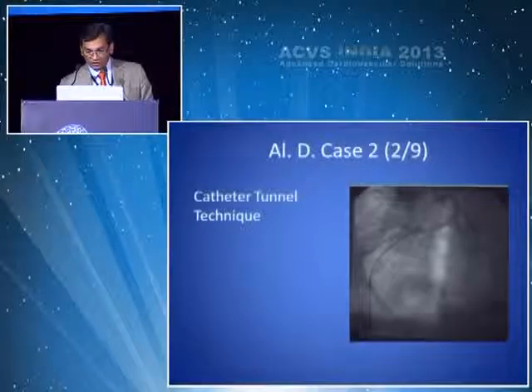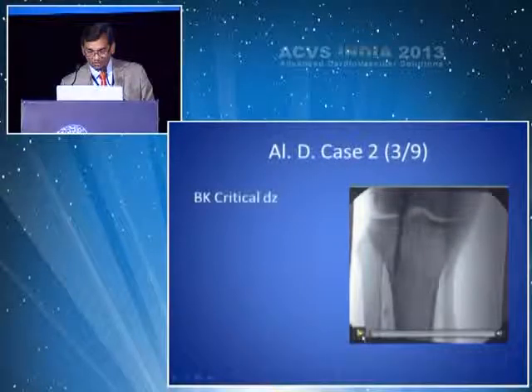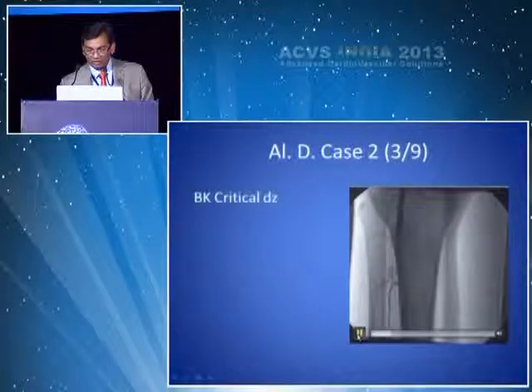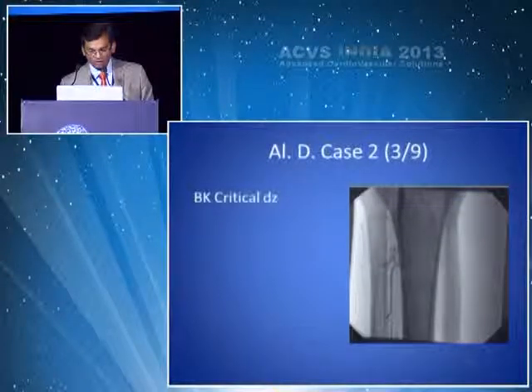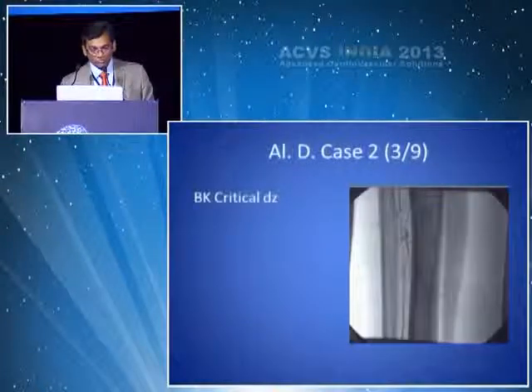Next slide. Here's the right side. As you can see, it's another critical disease, total occlusion that hooks up with the collateral.